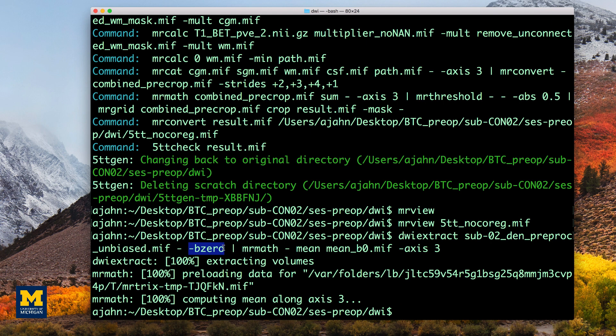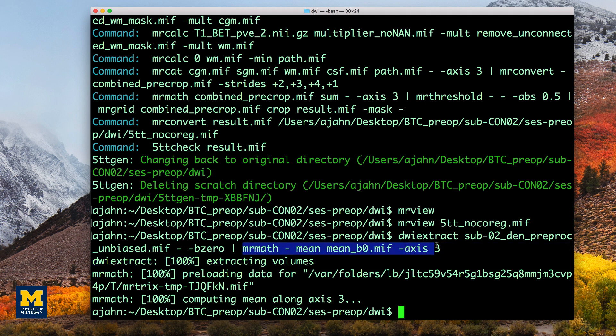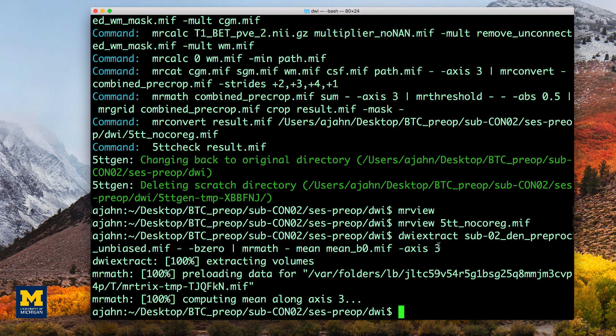The dash indicates that the output should be used as input for the second part of the command to the right of the pipe. mrmath then takes these output B0 images and computes the mean along the third axis or the time dimension. In other words, it averages across all of the volumes in that dataset.